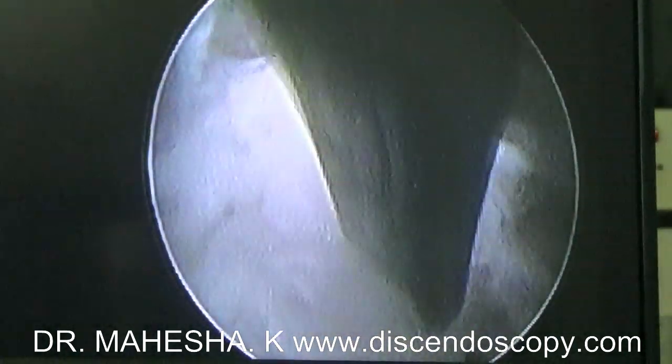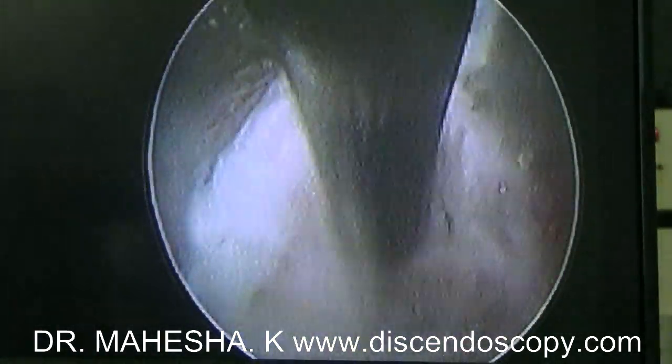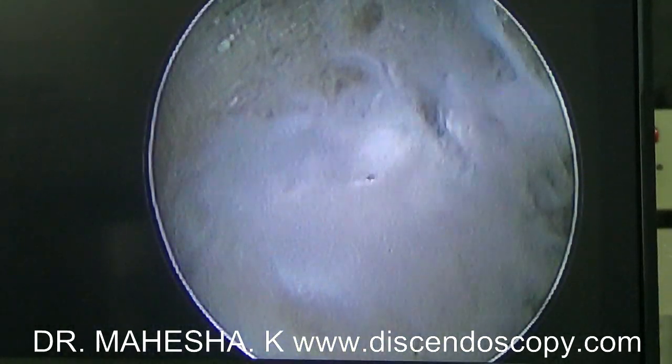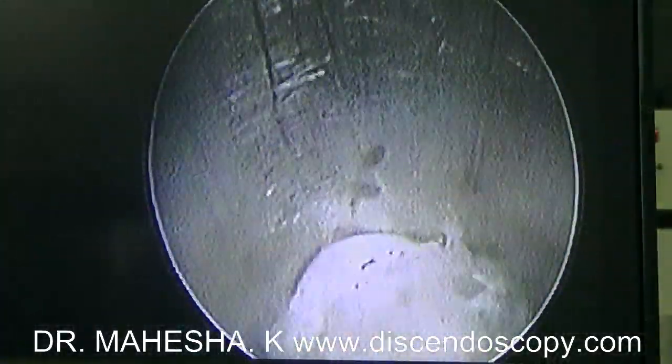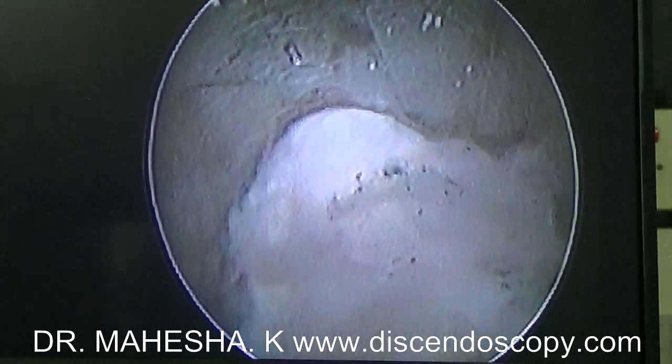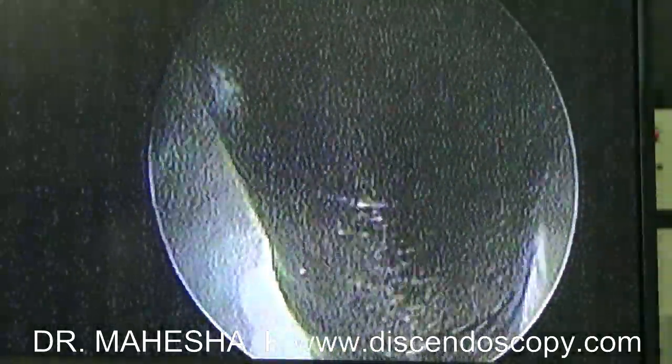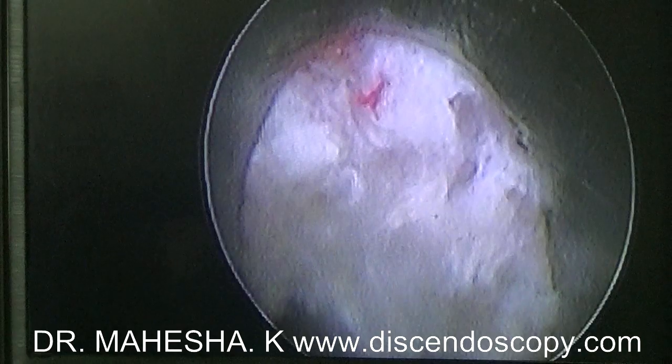I am using a hook to mobilize the up-migrated fragment. Once the fragment is mobilized, it is held with a grasping forceps and removed. We can see that the blood-stained fragment is removed, which confirms that the extruded disc fragment has come out.